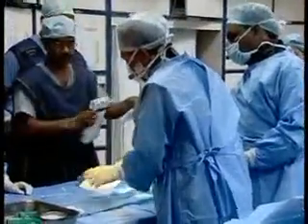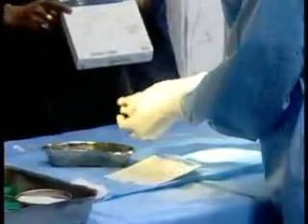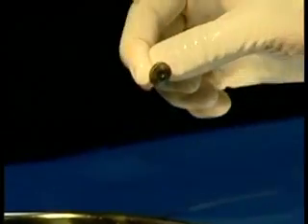So we are going to show you the device. You can see the ADO2 device here. You have to really focus on that because it's a tiny little thing. Can you tell the camera person to focus on this? Can you see the device here? Yeah, it's a bit hazy. If you can focus better. Can you come close to me? Yeah, it's better now.